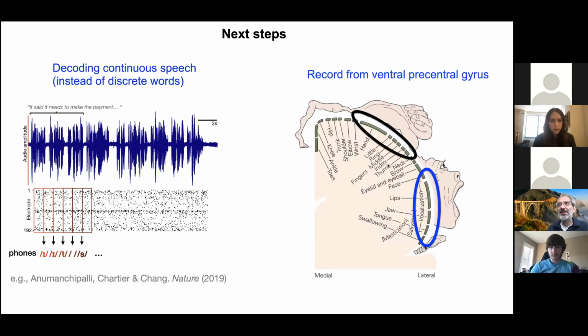Okay. And of course, let's not just put electrodes here, or we don't have to put them there ever again, but let's go more lateral. By opportunistically already having electrodes here and finding something, it's gotten us more enthusiastic about trying to go more lateral: ventral premotor cortex, or ventral precentral gyrus, maybe IFG, Broca's area, that range.